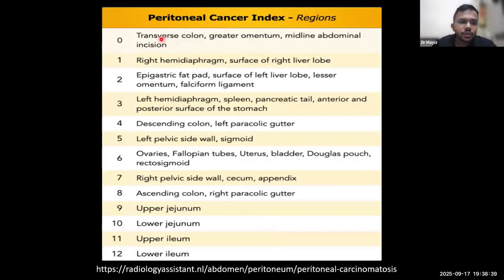Various organs which should be looked for in these 13 regions are tabulated here. You can take a screenshot of this, or it is available on the Radiology Assistant website.